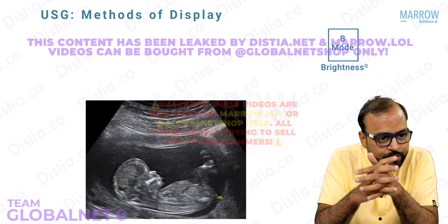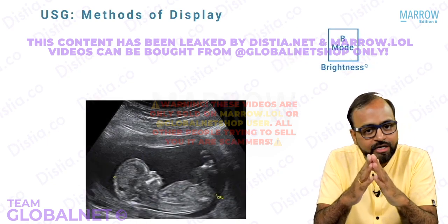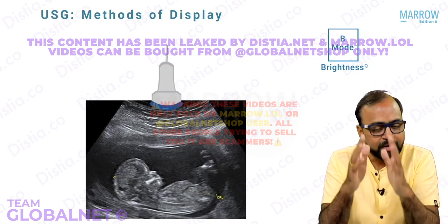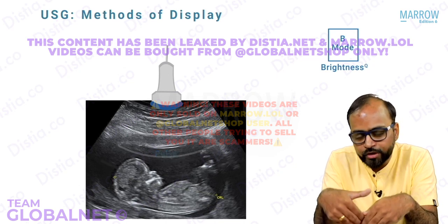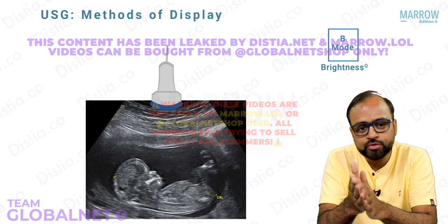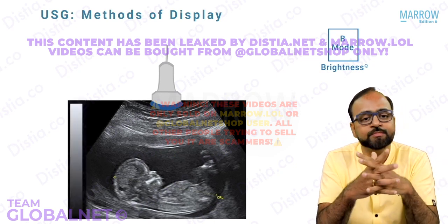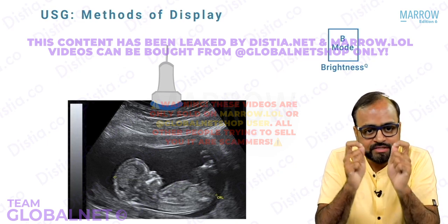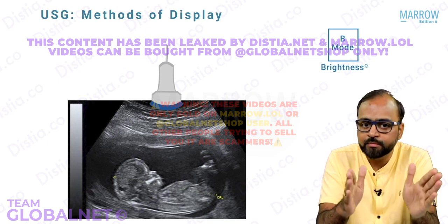See, in B mode of display, just imagine if I am trying to scan this area of the patient's body, and the ultrasound probe is kept, right? And a pulse is sent into the body and echo is received. Before we try to interpret this B mode image, look at the left hand side of this particular image, you will see a gray scale. This gray scale is the basis of this B mode image. It is there in every B mode image.